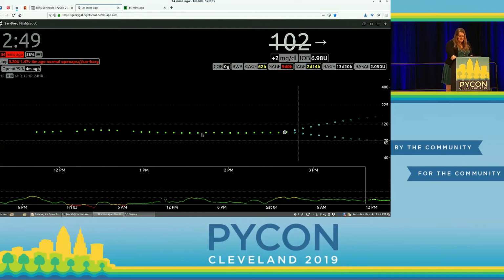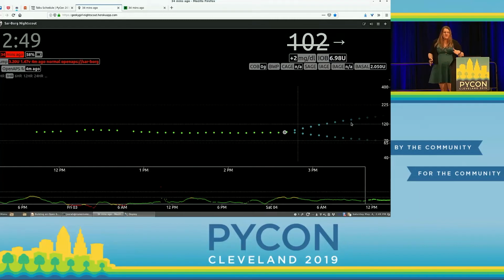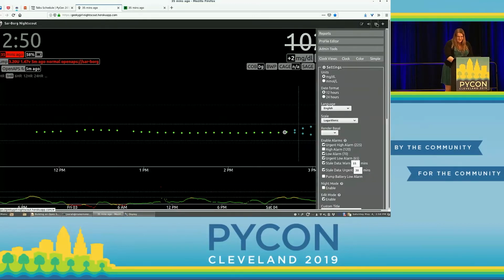So these little plot points here are individual data points. I don't know if you can see my mouse cursor at all, but the green dots are individual data points. The blue dots are its trends. So given one particular algorithm, it thinks it could possibly go up a bit. With another algorithm, it says it can go down a little bit. And it's not doing very good predictions at the moment because it hasn't gotten a value for a few minutes. I'm guessing just signal interference in here.